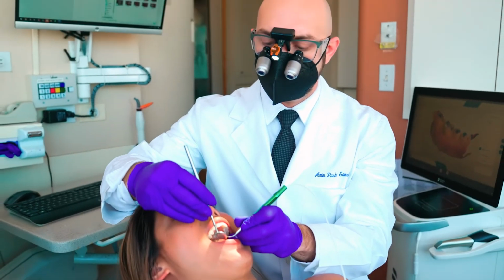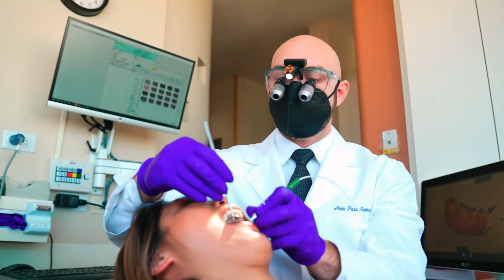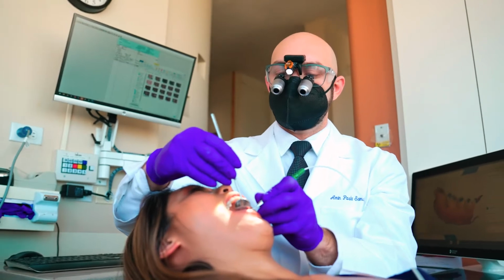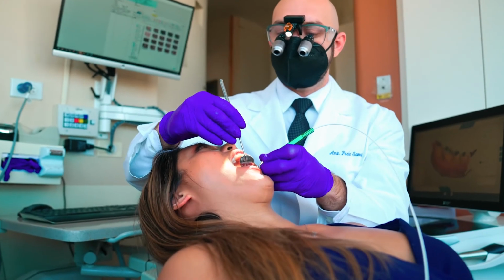The laser beam has this depth of penetration that goes 5 millimeters beyond the pocket. So the tiny little fiber optic of laser will go inside the gum tissue. All of that surrounding gum tissue will become sterilized because the laser has a very specific wavelength that targets that bacteria specifically, and it will kill the bacteria inside the cells without harming the cell.